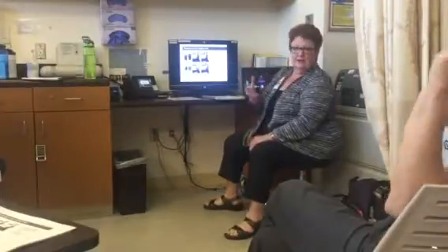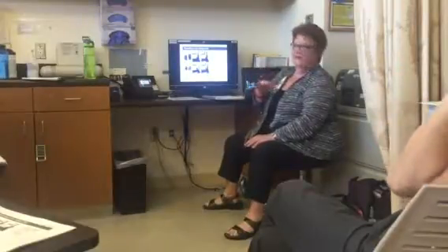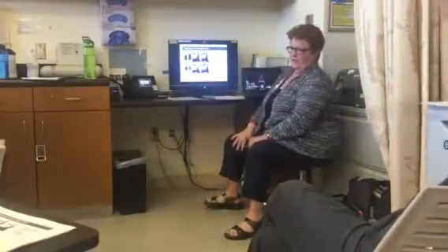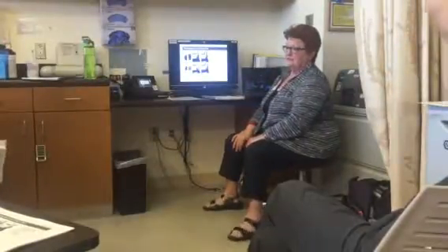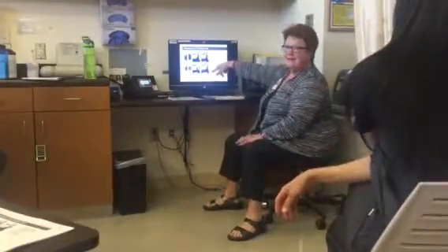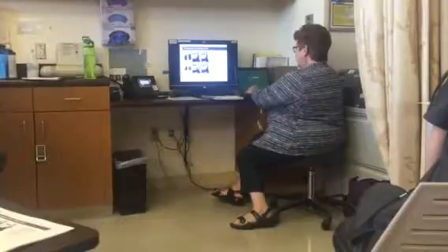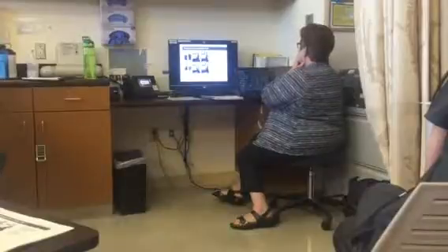If you're not used to putting your head in the hole, the viewport, to look at an interface, please start now. It has got to be as smooth as glass. Are these as smooth as glass? No, and we're looking to the left of the collect port. That is where you assess the quality of the interface. That is bumpy, raggedy, jagged, both of them. Those are platelet clumps sitting on your interface. Very easy to see. I will show you an actual one, the only one I've seen, from Seattle Cancer Care. Optia photo, I swear.